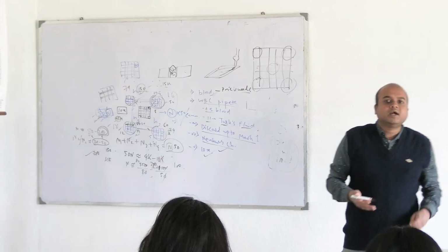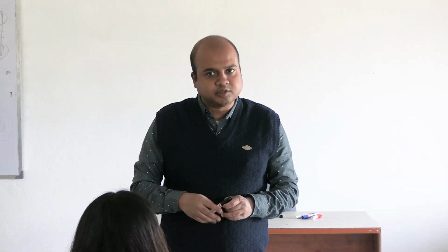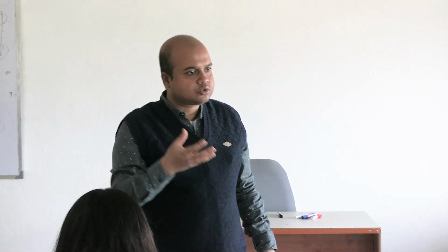Because theoretically we are saying blood is distributed uniformly. So my counting is done assuming that the distribution is uniform. If distribution is non-uniform, already my result is going towards some error. So considering distribution is uniform, whatever density of cells will be there in the central squares will be in the corner squares.